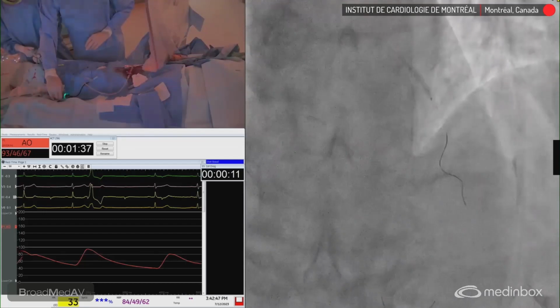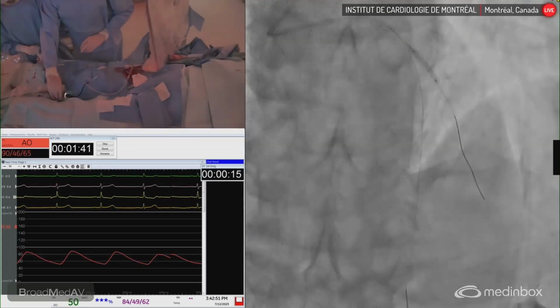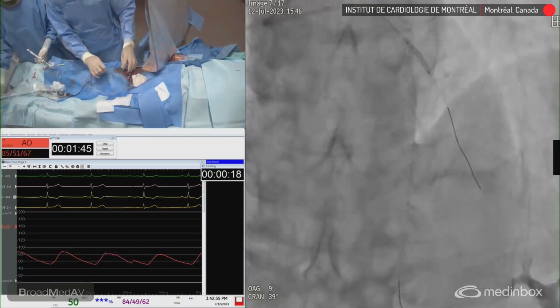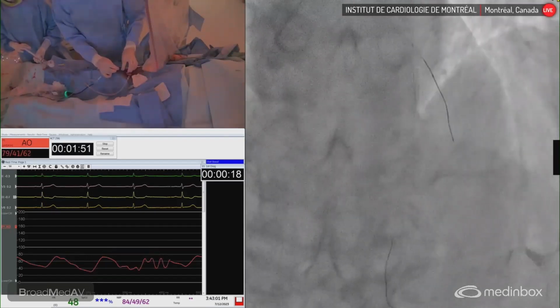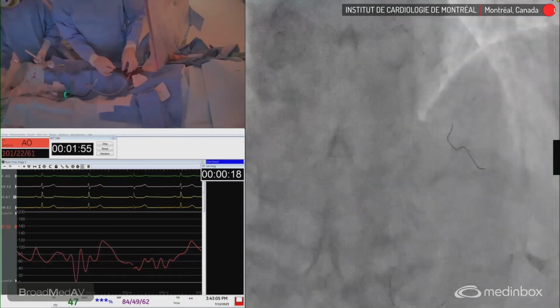Seems like it's opened up again nicely at this point. Off. So much better than our previous. Better, yeah, for sure. So we're sort of happy with that. A little bit further down again, if we can. The wires. Yeah, so some resistance here, of course.